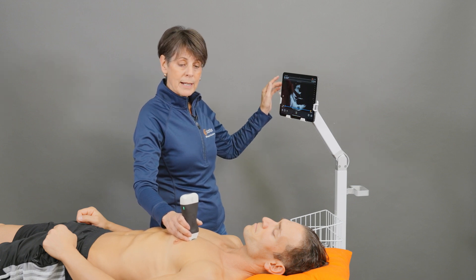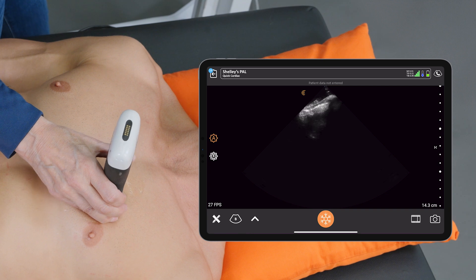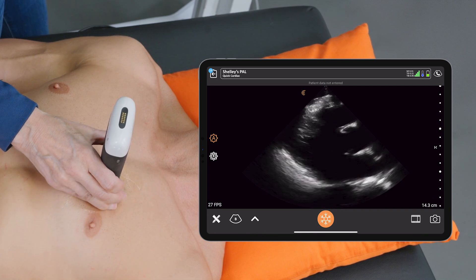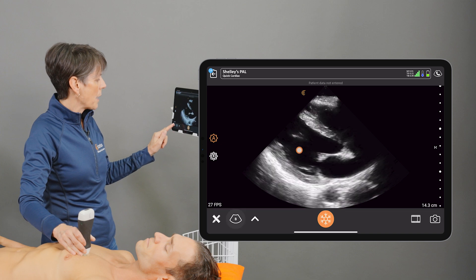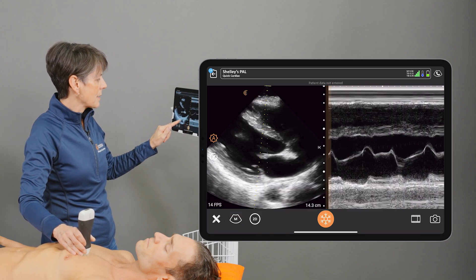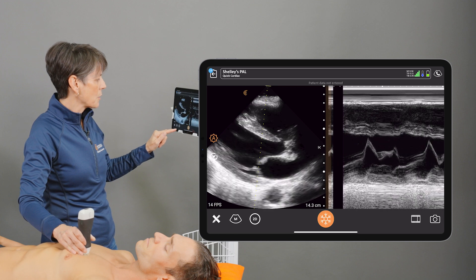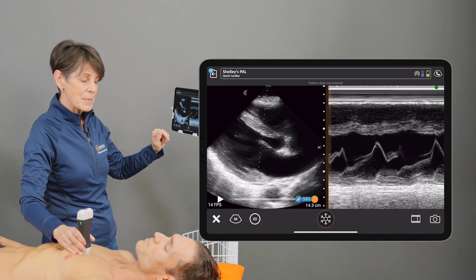I'm using the quick cardiac setup with the phased array scanner, and I'm just going to locate the mitral valve from the parasternal long axis view. We'll go into M-mode and place the M-line over the anterior mitral leaflet until we get a nice trace on the M-mode side.